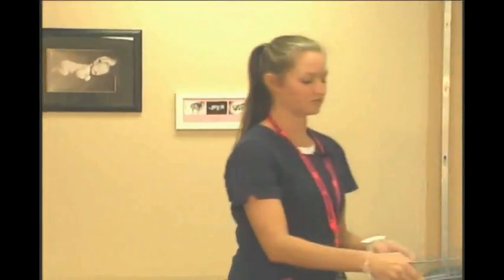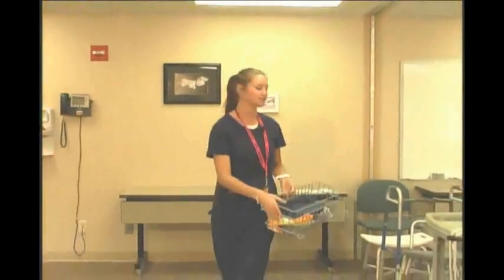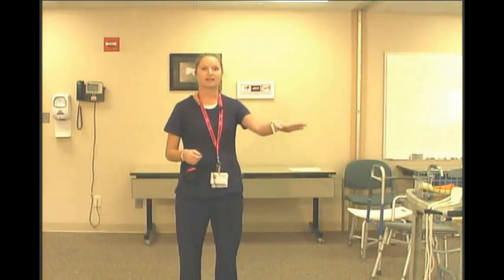Another form of equipment sometimes can be different walker bags, baskets, things that you can attach onto the walker to allow you to be as independent as possible. Please keep in mind that with the walker, we don't like you to try to carry anything in your hand and move the walker at the same time. It just promotes increased risk for falls, and we would rather have you use an attachment that will allow you to carry items rather than carrying them in your hand. This is especially important in the kitchen when you're carrying a plate of food from one location to another. We would prefer that you use the countertops. You slide the item along and you go from there.